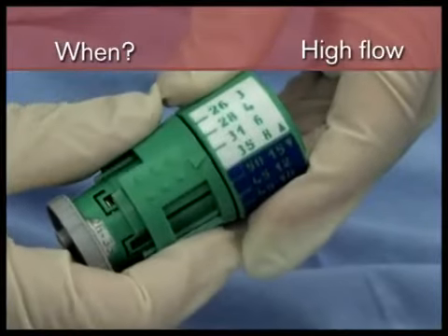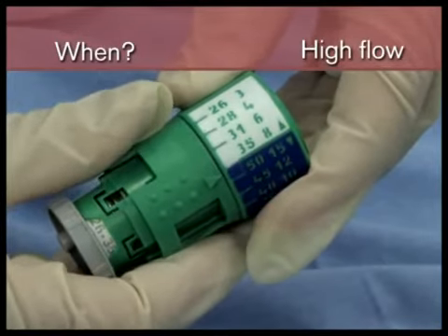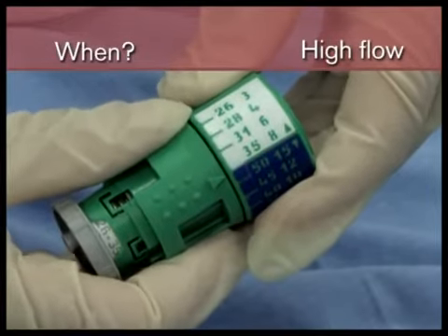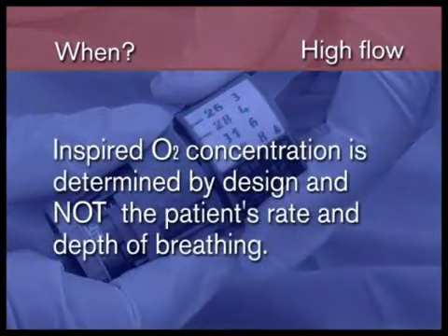In this instance, a high-flow device in which the oxygen concentration can be carefully controlled and guided by blood gas measurements is more appropriate. The inspired oxygen concentration is determined by the design of the device and not by the patient's rate and depth of breathing.